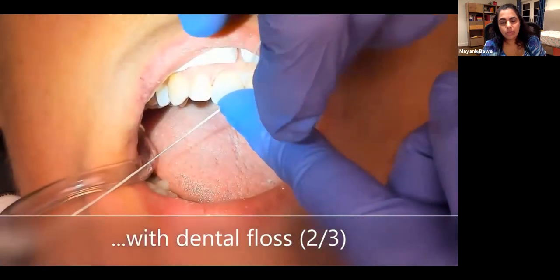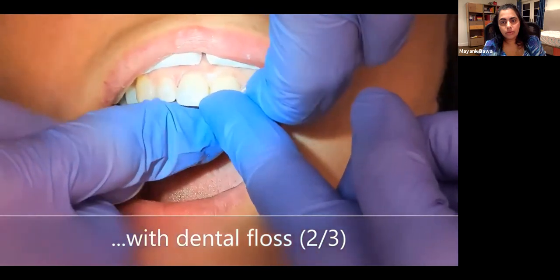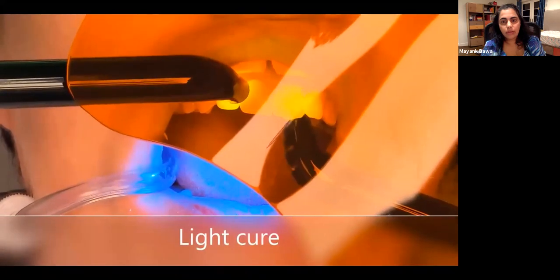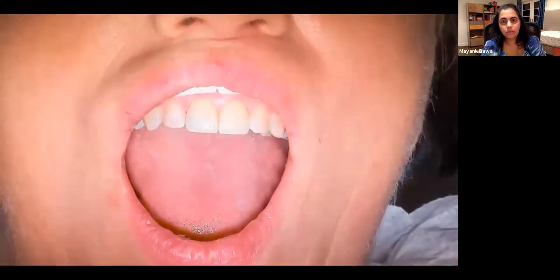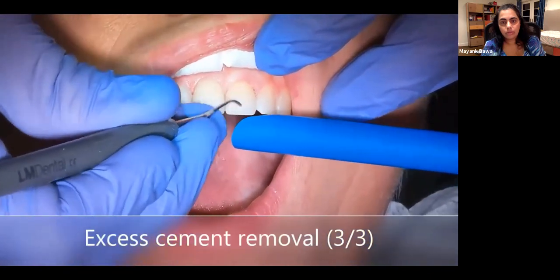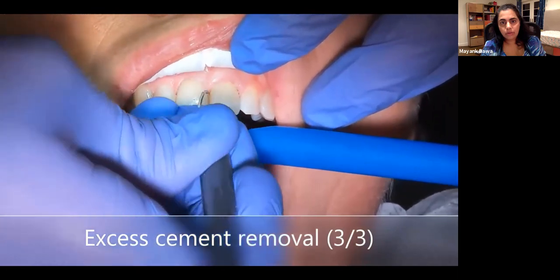And now they are flossing as well. A knotted floss helps take out all the excess cement from the interproximal, and then we do the light curing, 30 seconds on each side. I think it's almost 2 minutes. And they still have some cement that they're taking out.